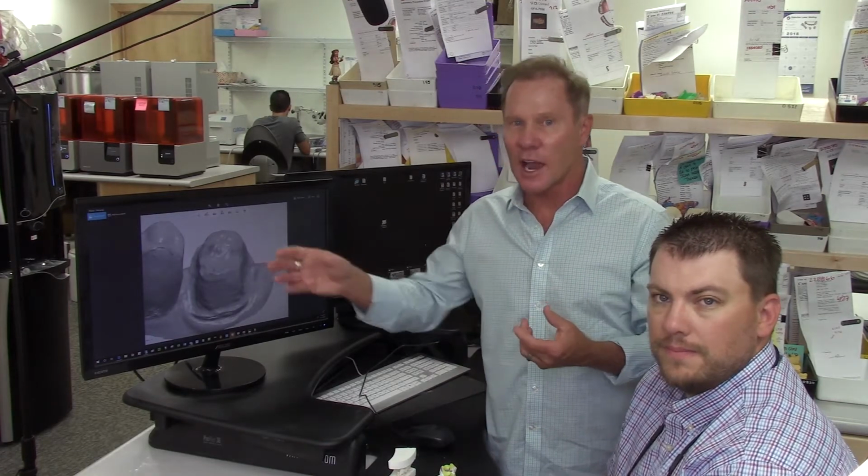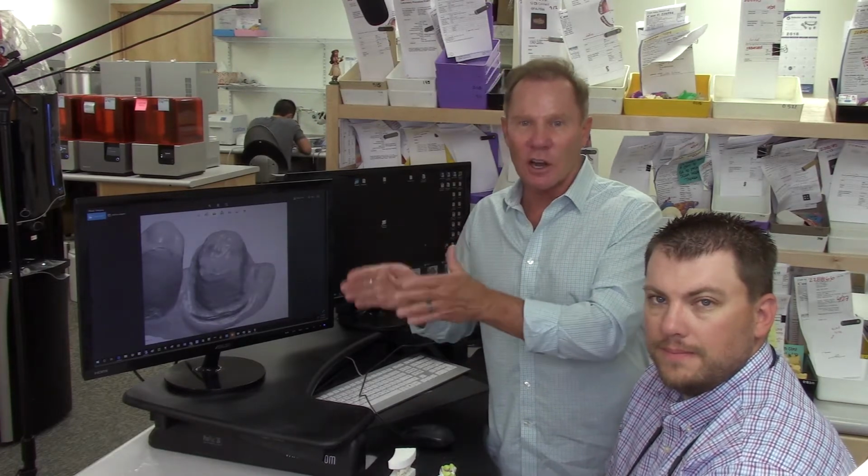But the nice thing about not having a model and having the accuracy of digital dentistry is we get a better fitting restoration, we get better occlusion, we get better bites because that's done digitally in a static bite, and it's less expensive. The fact that the lab is not required to make a model, literally it's $25 off the normal fee, so there's a huge advantage of that.